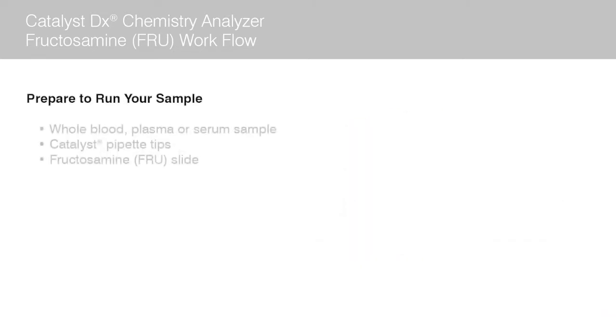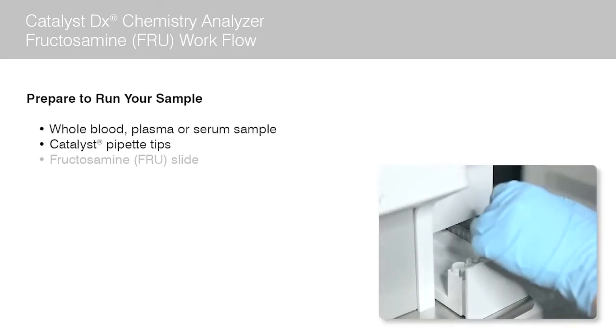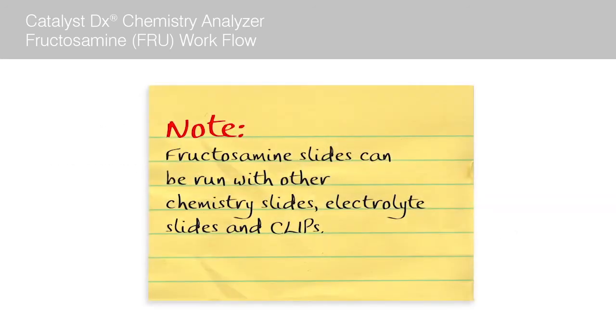Before you begin, it's always good practice to have the following supplies and equipment on hand, staged and ready to go. You will need a whole blood, plasma, or serum sample. You will need to make sure the tip drawer on your Catalyst DX is full before you start any run, and you will need a box of fructosamine slides. Note: fructosamine slides can be run with other chemistry slides, electrolyte slides, and clips.